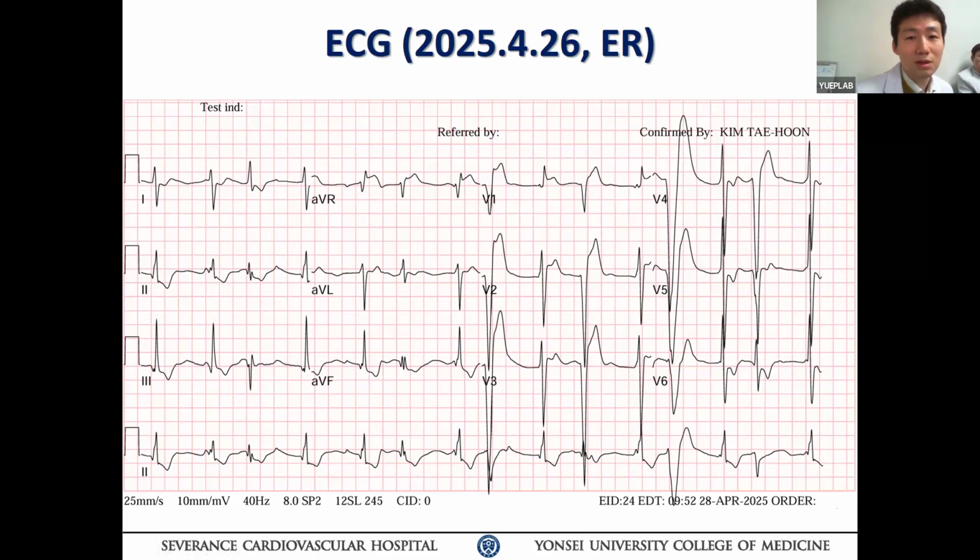Any other comments? I suspected this could be the conduction of P wave and QRS, and P wave and QRS. And I think this rhythm seems similar in here. And maybe this could be a long PR interval and conducted, and very long PR. Yeah. Did you measure this interval and this interval? I think the later one looks longer.